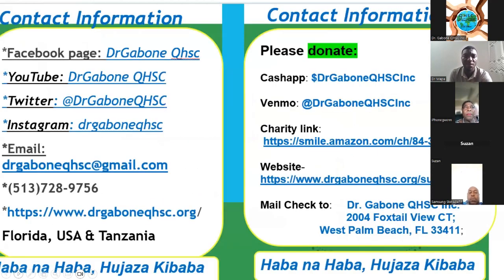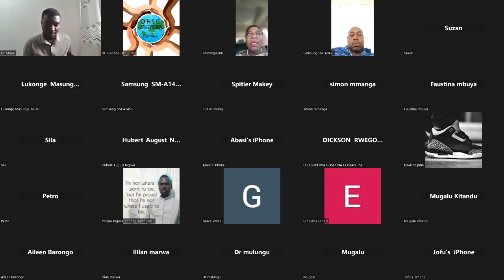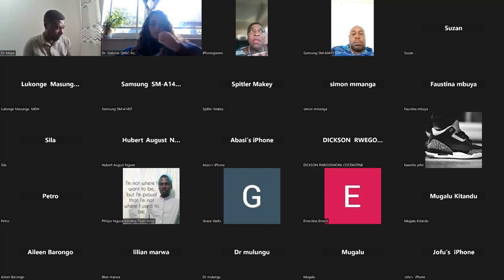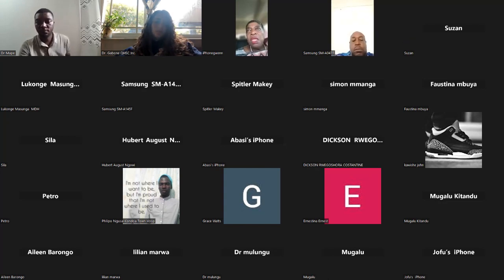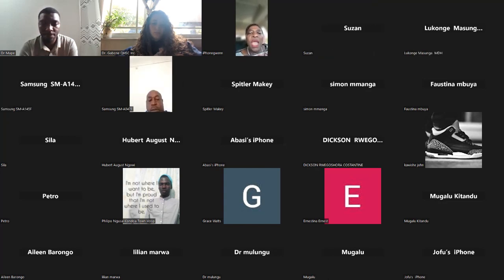Now I would like to welcome Dr. Gwen. Dr. Gwen, welcome. What I would like to say is, what are some of the challenges that the participants can anticipate? And I want to let you know that if you can't have a big difficult airway cart, then there are some other options. You can get a fishing tackle box, which has three tiers to it, and you can start to stock that so that it is portable no matter where you go.